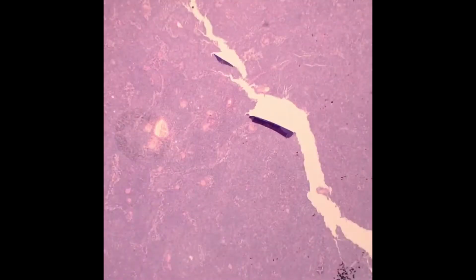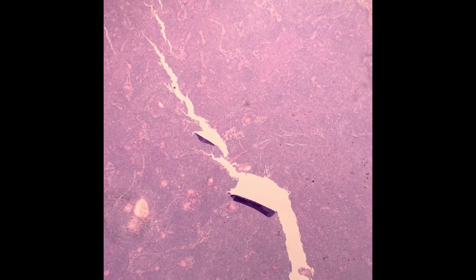The architecture is that of a very monotonous process. It has partial effacement of the lymph node, preservation of sinusoids in some areas, a little bit of hemosiderin, and some plasma cells in there, which we'd like to know whether those are clonal plasma cells or benign plasma cells, whether they're part of the tumor or not. And our differential now, assuming that we don't have one of the oddballs, is really the marginal zone lymphomas, lymphoplasmacytic lymphoma.